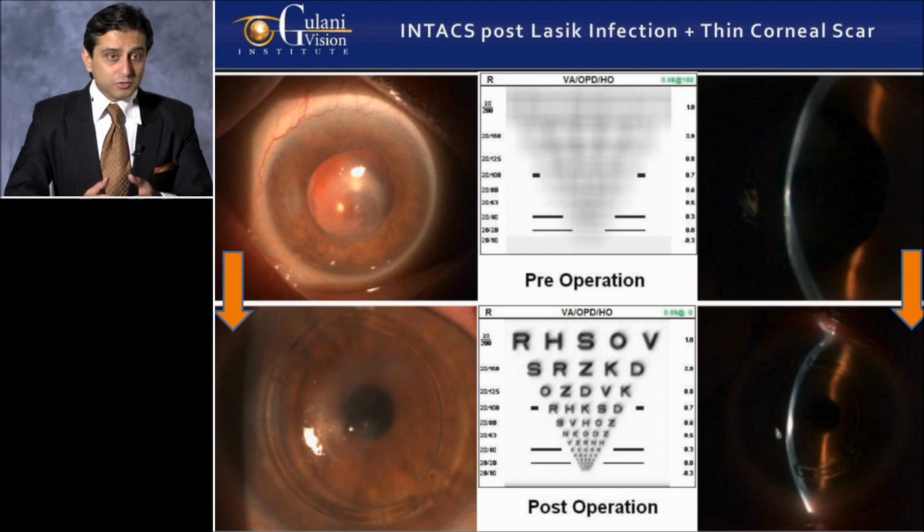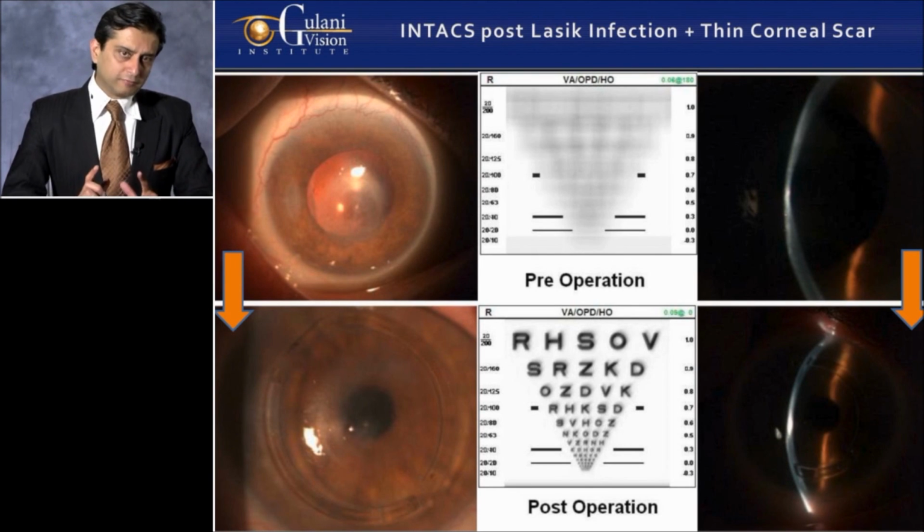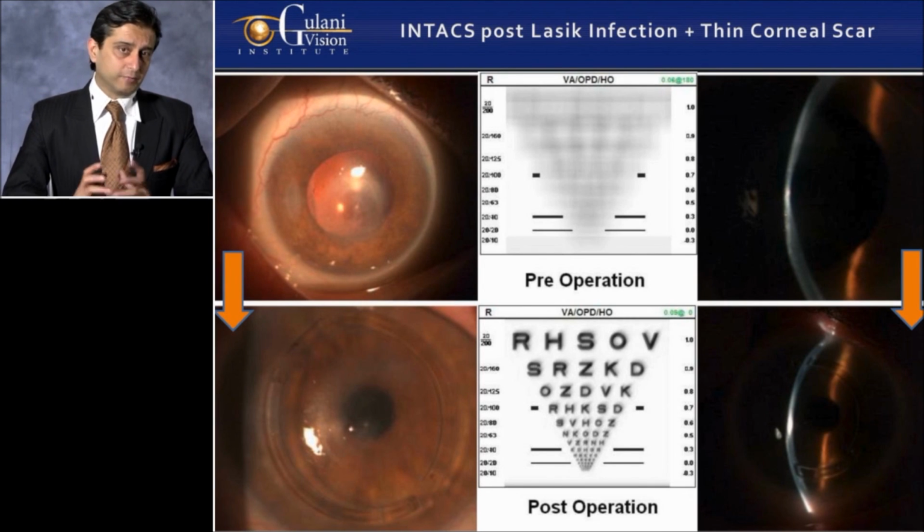And the cornea being thin is no issue now, because just like keratoconus, you have stabilized it using rings like braces in the periphery. So this thought process of designing surgery for cases, no matter how complex, unique, or difficult, and taking them to a self-designed surgery to the best emmetropic, what I call best vision potential outcome, I think is the need of the hour. The OPD-3 gives me a lot of the information that I need to discuss with the patient in the room, why I came to this plan, and then decide with them so they become a team with you. A team where you're going step by step towards better vision based on logic and safety.